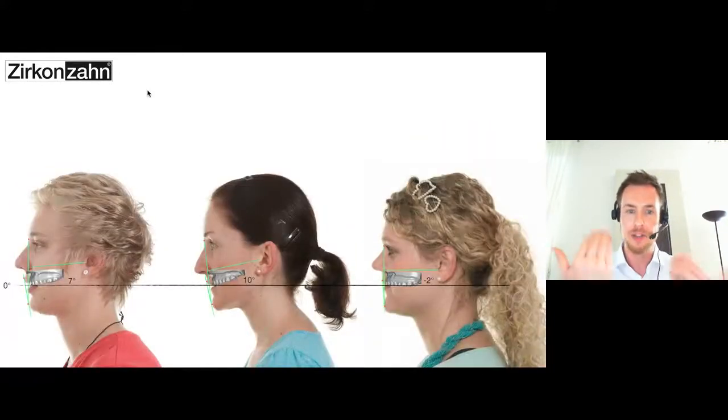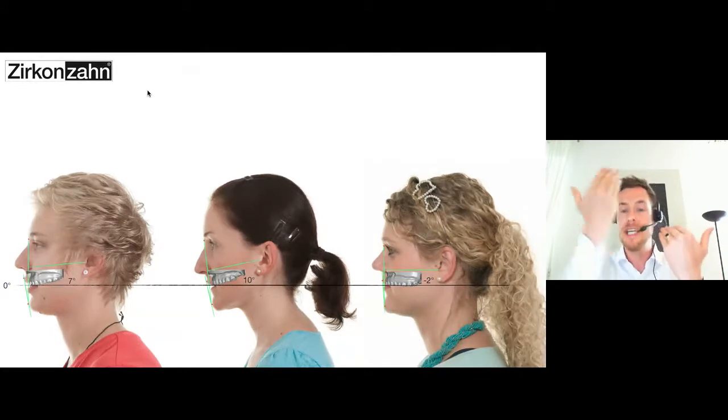And after the measuring, we get different results, not just different results for each patient, obviously, but different results on each facial side, because we as humans, as patients, are asymmetric. It means onto the left side, we have a different angulation than onto the right side.